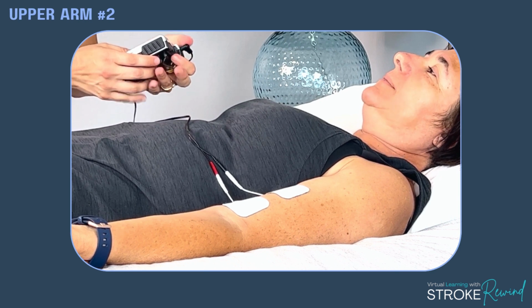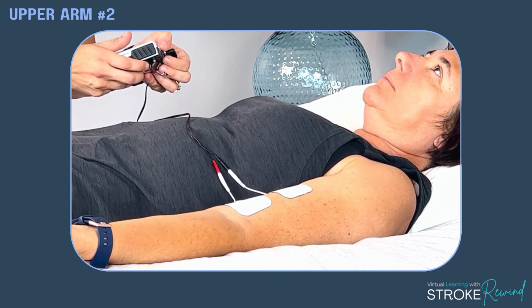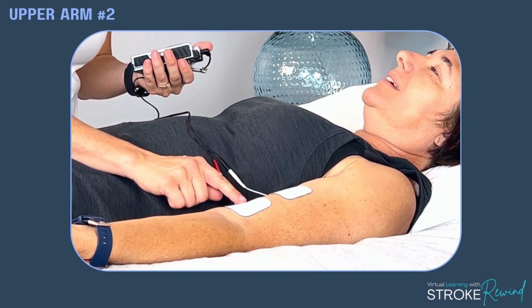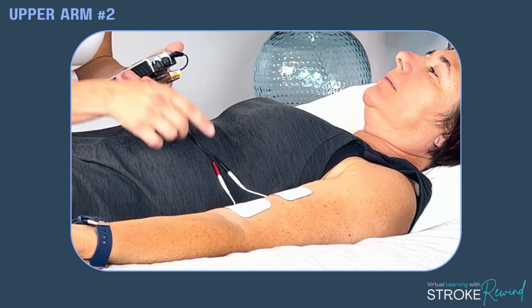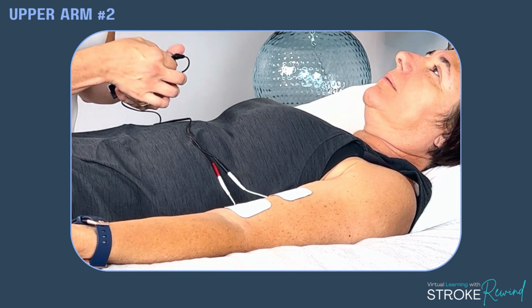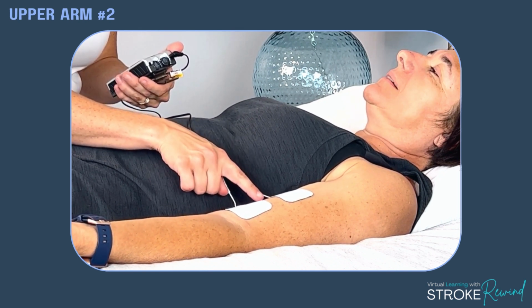I can feel it. Okay, so now once you can feel it, as long as it's within comfort, I'm going to start moving it up until I see a movement. Ooh, that jumped a little bit. Did it hurt or was it just scary? No. Just a little scary. You can see, if you look closely, there's a movement. Now, sometimes that initial movement will scare the person, but can you guys see the movement in here? Can I go up a little more? Does that feel comfortable? You could go up. There we go. You see that bicep?